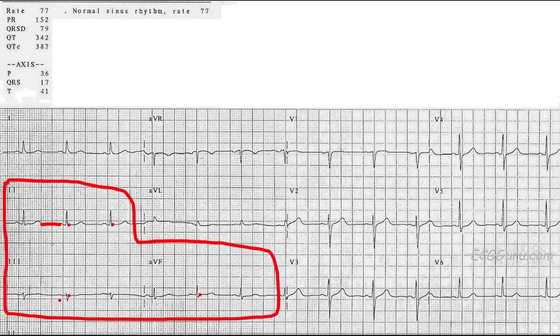If you have a tachycardia and can't see the TP segment because it's too short, your next best choice for baseline is the PR segment, which is in front of the QRS. In a normal ECG, we want to see the J point in line with the baseline or isoelectric line — not elevated and not depressed — and we're seeing that here.